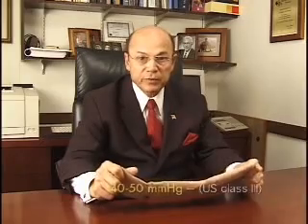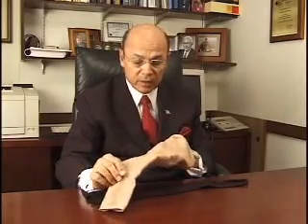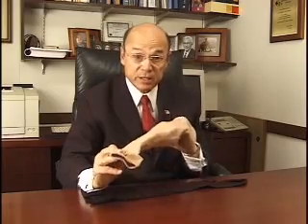The Class III stocking is an even heavier product with a pressure of between 40 and 50 millimeters of mercury. These stockings come in several materials, and the one shown here is a heavy rubber model which will hold its compression all day long. The downside of this stocking is that it's difficult to put on, and it also doesn't breathe very well, making it not suitable for warm climates.